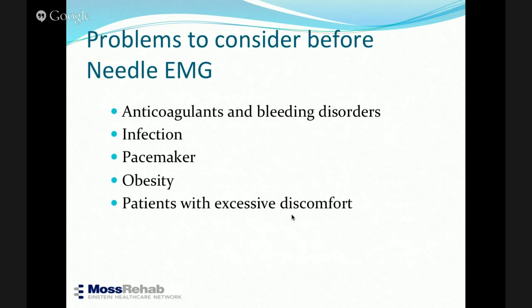Problems to consider before needle EMG: bleeding disorders, anticoagulation, infection, pacemaker, obesity, patients with excessive discomfort. So you want to really look at all of those things and address those things up front.